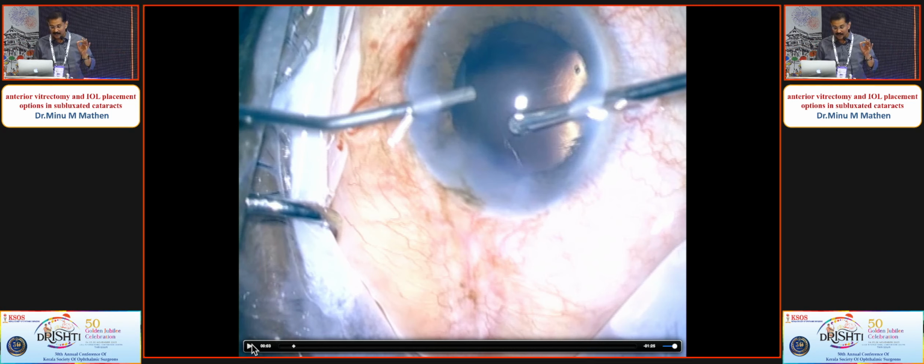And it is not yet time to write off ACIOLs. This is what Dr. David Chang himself says. He said that 3-4 months before in the Andhra Pradesh annual meeting, when we had his virtual conference. So I personally asked him at that meeting itself, sir, don't you have that reference with you? He said, yes, there is a meta-analysis published in Ophthalmology telling that if you do everything properly, ACIOLs have the same outcome in the long term as the scleral fixated. Iris fixated is not studied because it has recently come, and so that's not there.